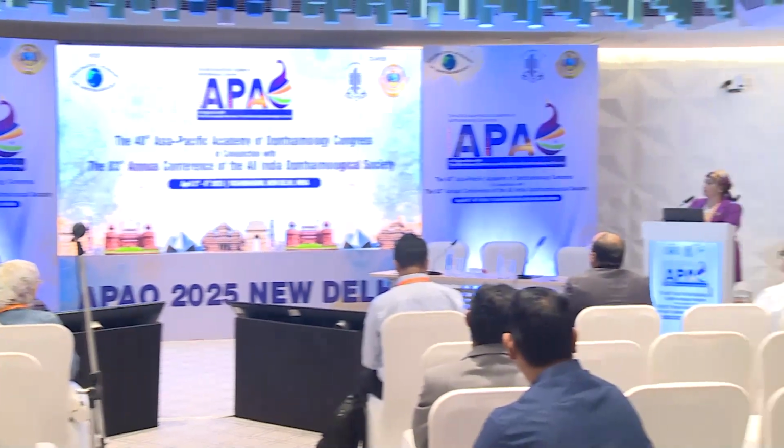Any of the biomarkers that you look at for deciding what kind of anti-VEGF or treatment modality you would be using? Yes, for me, if I see subfoveal edema and subfoveal neurosensory detachment and good vasculature of the choroid, I will go more for steroid injections, even like triamcinolone alone, it will respond dramatically better than giving anti-VEGF.